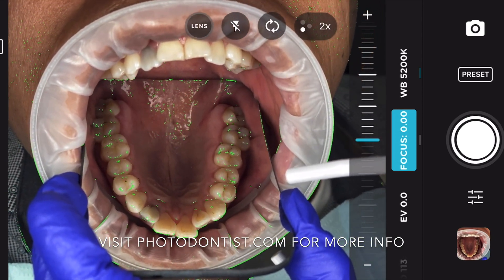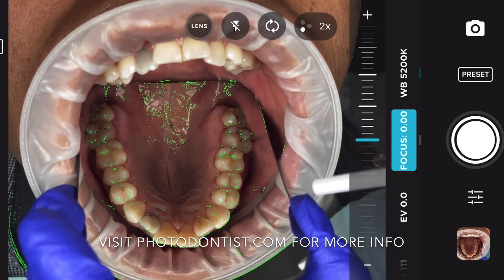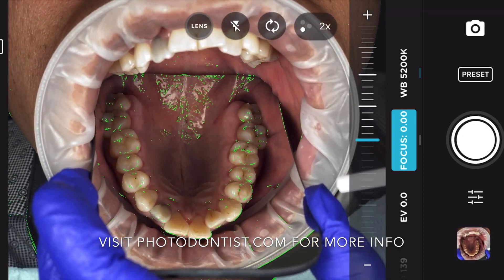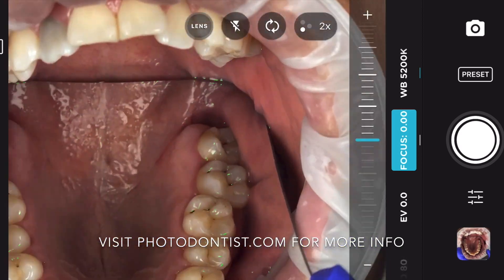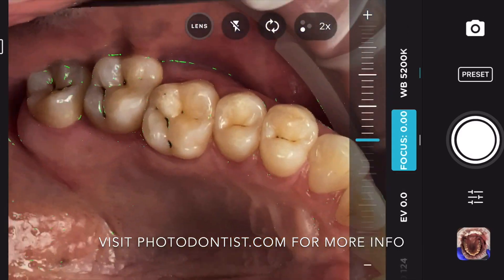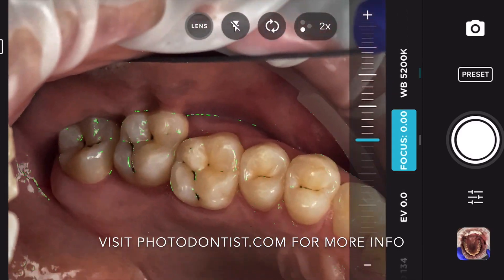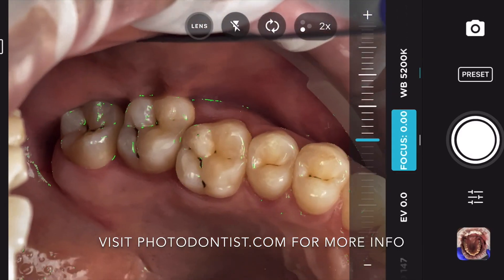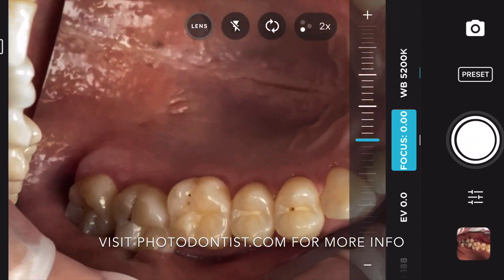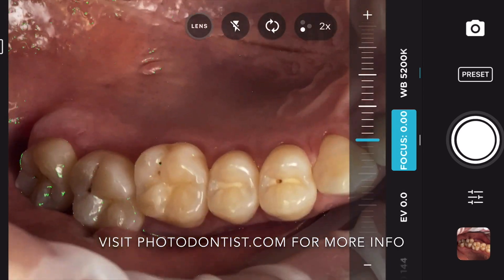I'm using the 2x telephoto lens, but you can also pinch to zoom to get a closer crop of the teeth. I don't think this really helps because it's digital zoom, but it might be better for composition reasons for you to zoom in and get that for presentation. I found after I did this shot and was showing the patient these photos, it was better just to start from his full arch occlusals and zoom on in.